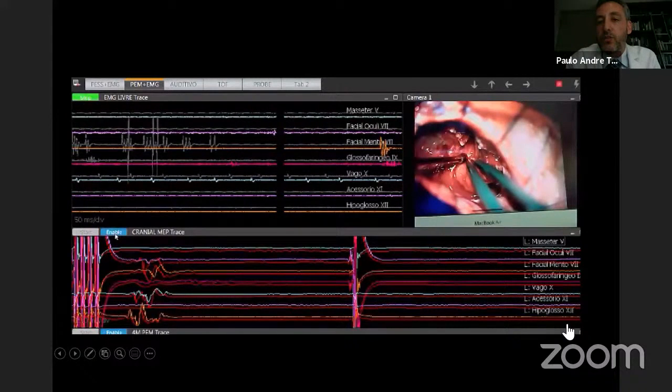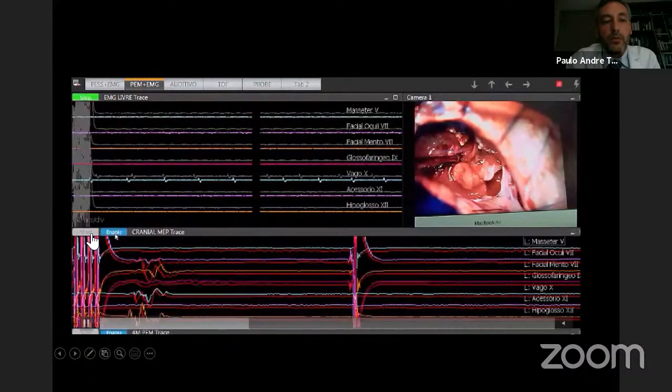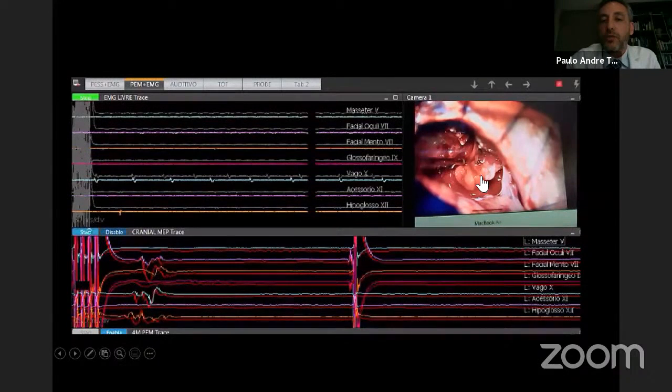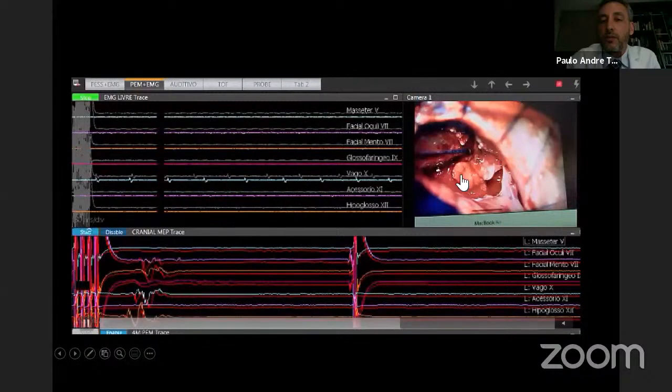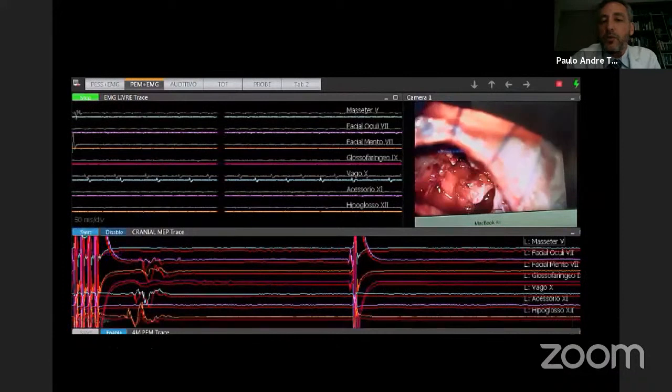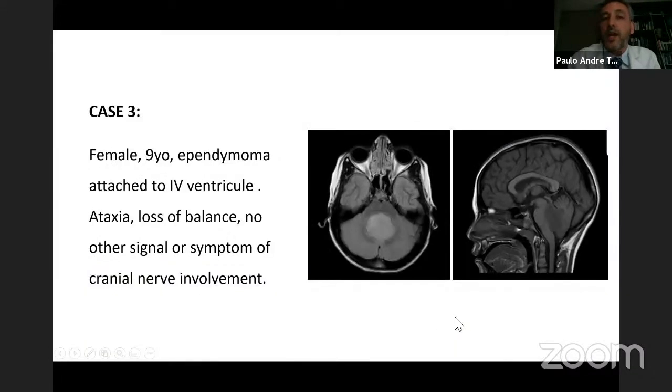The surgeon is doing the surgery here, and I will enable the stimulation, and I will do the stimulation here. I'm using a single node, but I'm using isolated stimulation. I do stimulation, and I do it again, and there is no movement in the field. So I can do this more frequently without disturbing the surgeon. Sometimes we see just the pulse of liquor, and there is nothing more than that. So we can titrate the intensity of the stimuli to do this continuously.